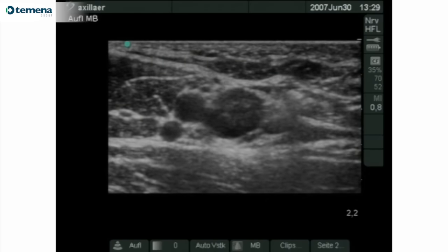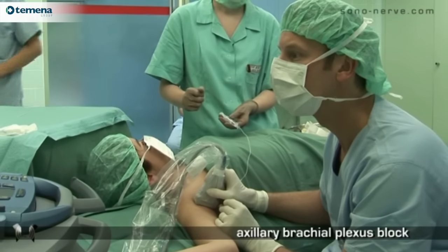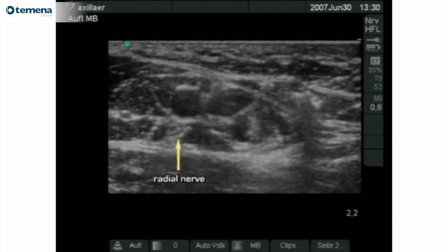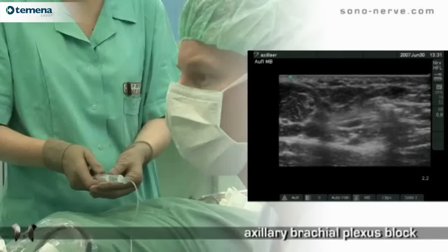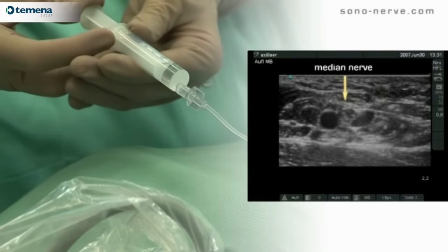Secondly, the needle is passed posteriorly to the vein and artery towards the radial nerve. Once the needle is close to the radial nerve, local anaesthetic is injected. Then the needle is withdrawn and passed anterior to the artery so as to place local anaesthetic around the median nerve.